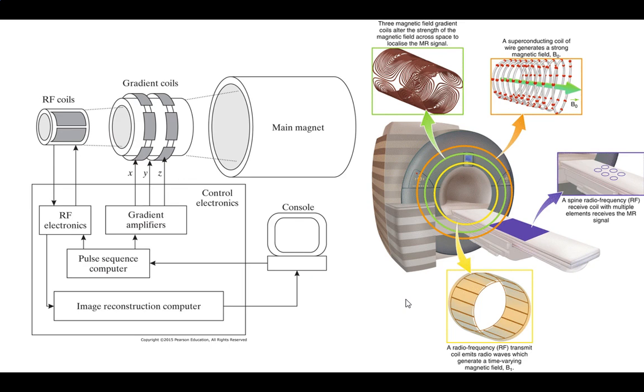Yeah. So most of the people doing this, they kind of consider the main magnet and the gradient as the magnetic field. And they consider the RF not the magnetic field. And this kind of gets to the question you had asked last time, when the book says it's not magnetic field, and I hemmed and hawed about it. It's because nomenclature-wise, we would not call it magnetic field.